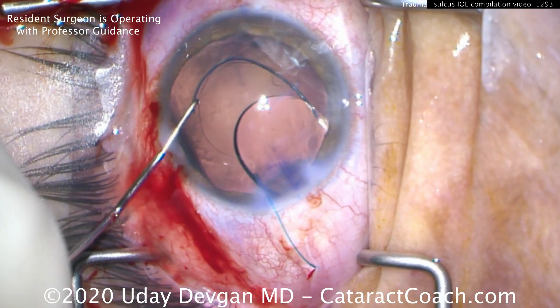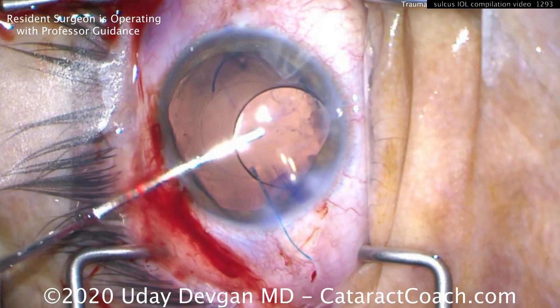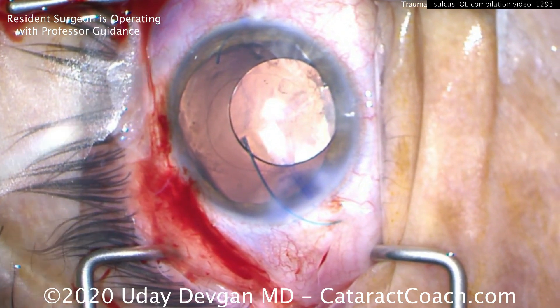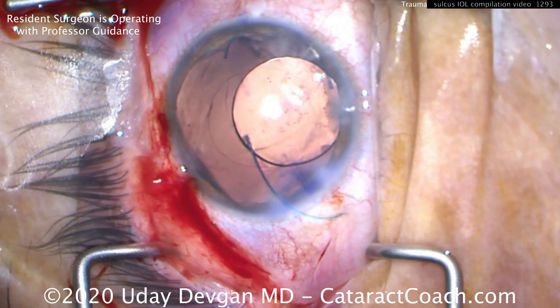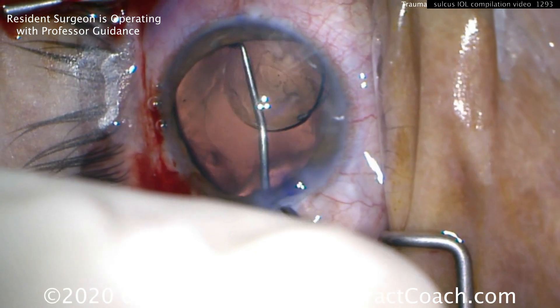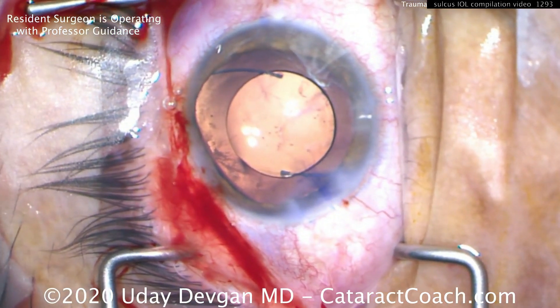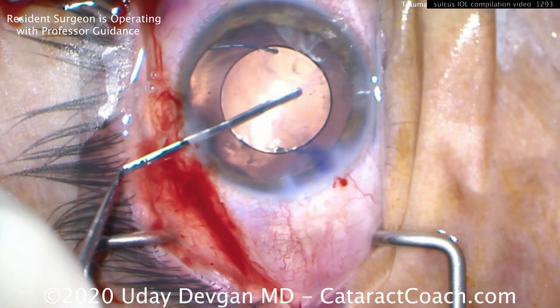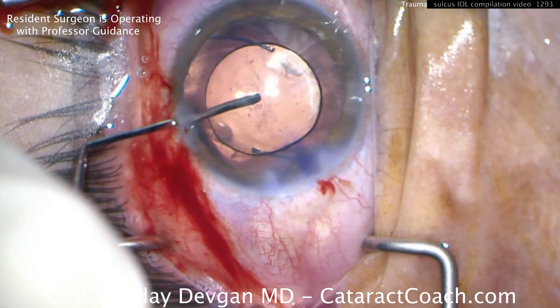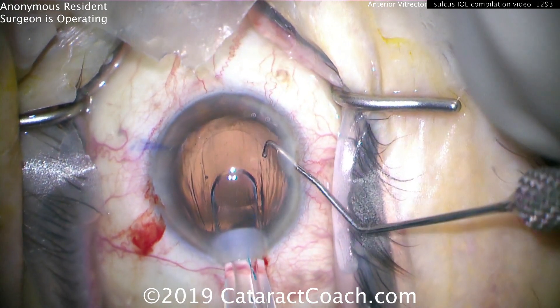We're going to push the optic behind the rhexis — like a button through a buttonhole on your dress shirt — capturing the optic into position for an incredible degree of stability. The CTR is inside the intact capsular bag pushing outward on the area of zonular loss. The IOL will be a three-piece with haptics in the sulcus and the optic captured behind that intact five-millimeter rhexis. This is a resident case — the surgeon has done maybe a hundred cataracts. Tuck that optic under the rhexis — this is incredible long-term stability; this IOL will be good for the rest of the patient's life.